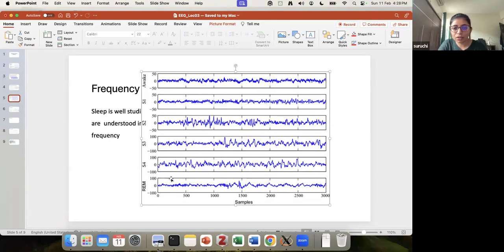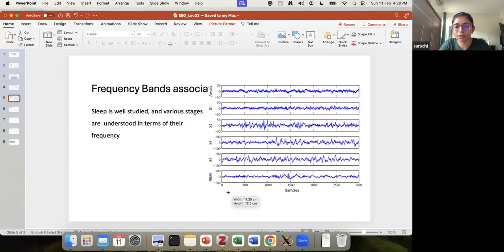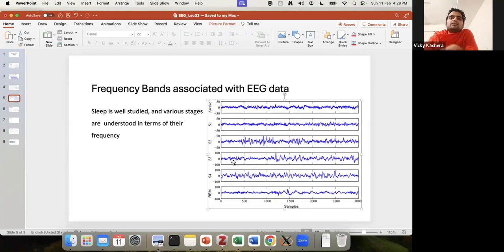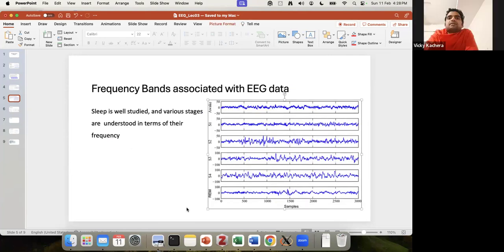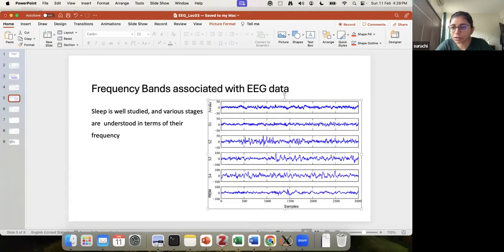And there's something called a sleep spindle, and I'll show you next time. So today I just want you to first understand what frequency is, then you can do these things. And then the second thing is amplitude, of course. What is, how big this is. Why did I mention the samples there, not the timing? I think that might be from a paper, and they discussed the sampling rate, like 500. We'll go to the coding thing, and unless you do it by your hands, it'll be difficult to understand.